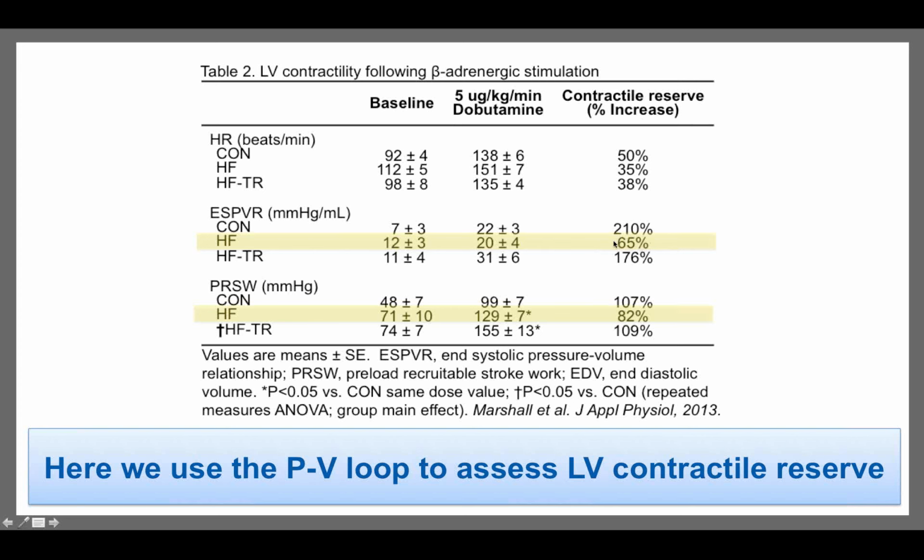We saw in the heart failure group that it was indeed depressed, as you would expect in this particular patient population. We see that in our model as well. And with exercise training, we're actually able to preserve that contractile reserve.